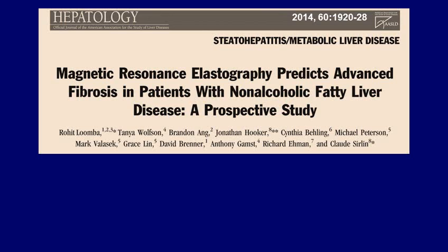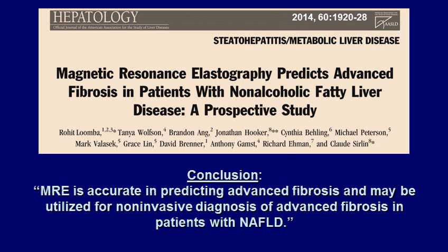And here is yet another study that was recently published in 2014 that looked at patients with non-alcoholic fatty liver disease. It was a prospective study comparing MRE and biopsy. They concluded that MRE is accurate in predicting advanced fibrosis and may be used for non-invasively diagnosing advanced fibrosis in patients with non-alcoholic fatty liver disease.